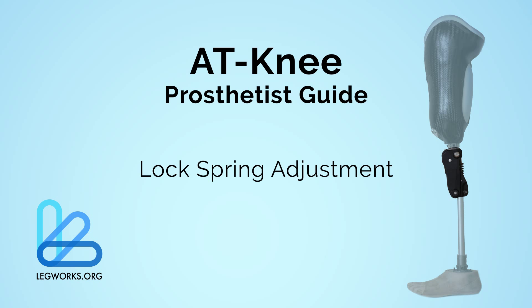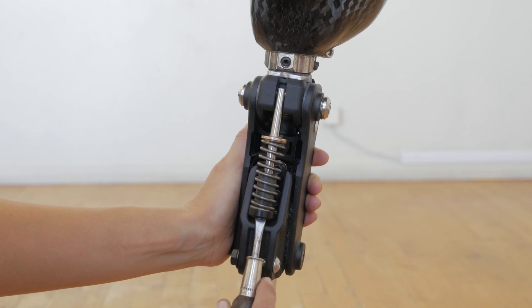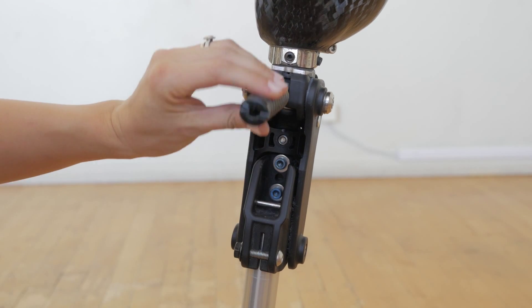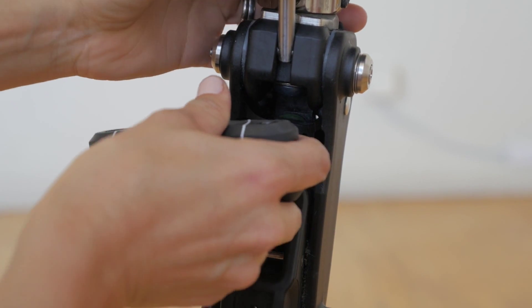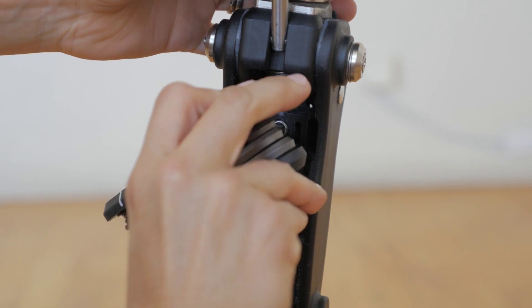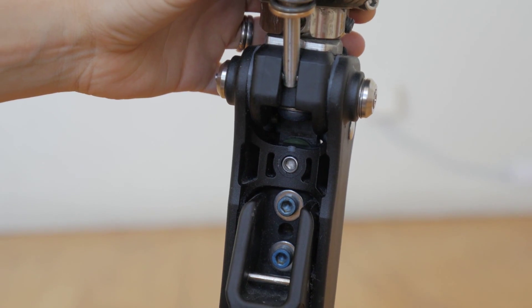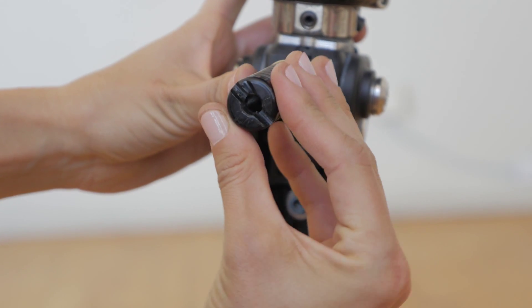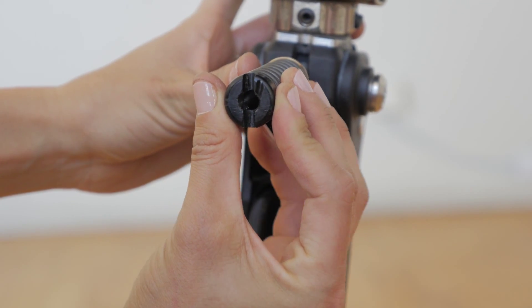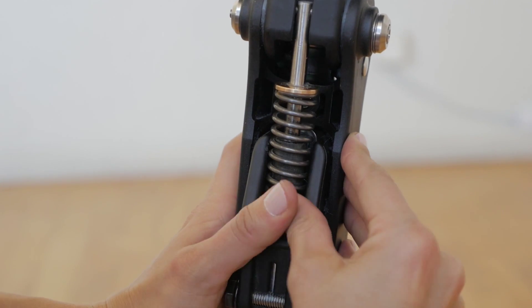Once the extension assist is out of the knee joint, the lock spring can be adjusted. The lock spring controls the amount of force pushing the lock into the locked position. Tightening the lock spring makes the lock more difficult to unlock, and loosening the lock spring makes it easier for the lock to unlock. Tightening or loosening to extremes may cause the knee to not properly function — for example, not unlocking or not locking.